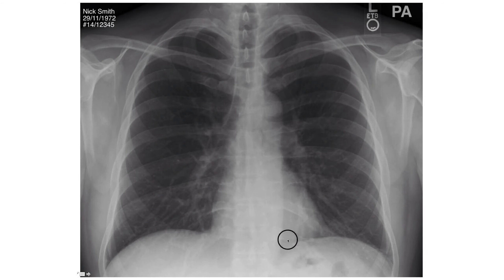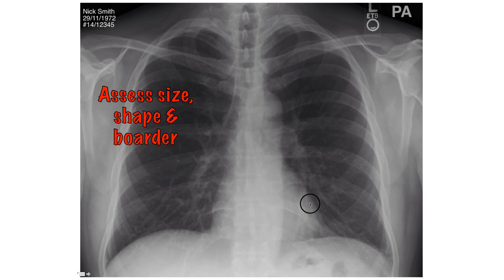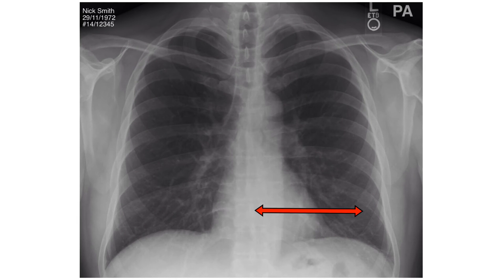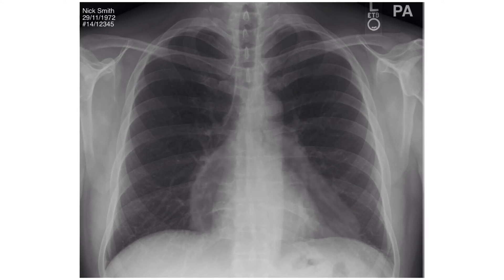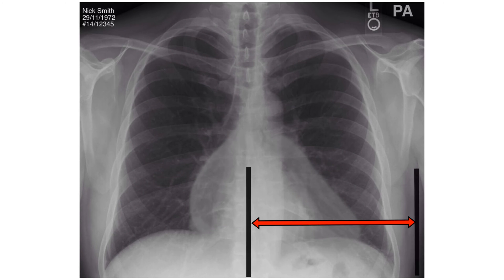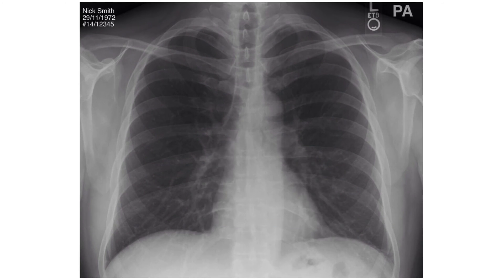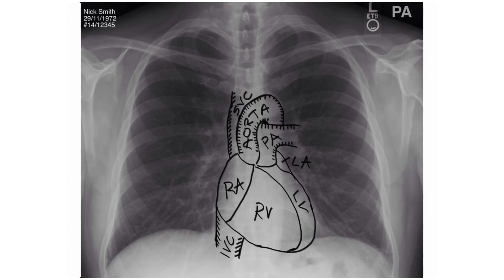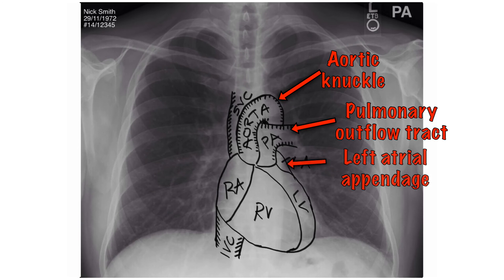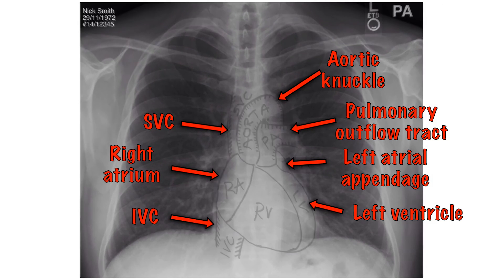Look at the size, shape and border of the heart and mediastinum. Heart size is assessed using the cardiothoracic ratio. In a PA film, the heart occupies less than 50% of the width of the thorax. A cardiothoracic ratio of greater than 50% in a PA view is abnormal and indicates cardiomegaly. Structures making up the left border of the mediastinum include the aortic knuckle, pulmonary outflow tract, left atrial appendage and left ventricle. On the right side, the border includes the superior vena cava, the right atrium and the inferior vena cava. These borders should be well defined. A blurred edge could indicate collapse or consolidation of the lung.